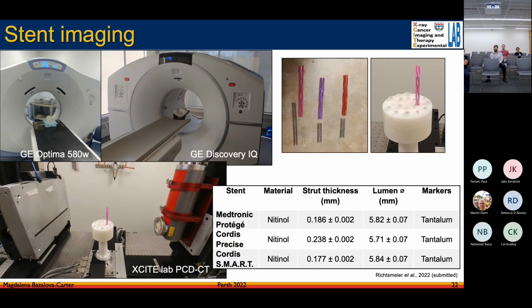Okay, and not the last one, but the second to last study that we have performed quite recently, in August I think, was stent imaging. We started working with a radiologist who was really interested in how well we can do for stent imaging. Stents are put in arteries to make sure that the blood can flow through. They're these tiny, really complex structures, and apparently very expensive, like thousands of dollars, which I did not appreciate. So I'm happy we have them from our radiology collaborator.